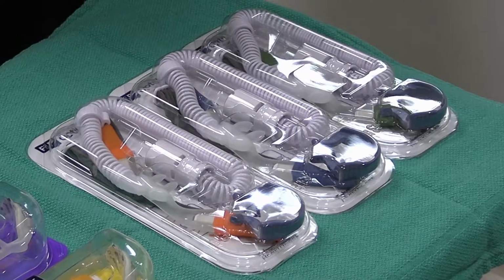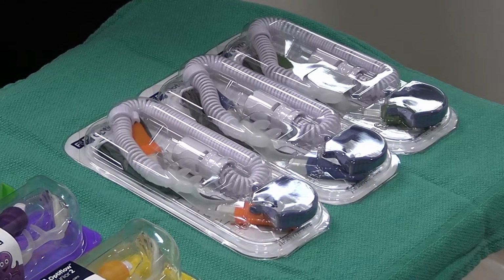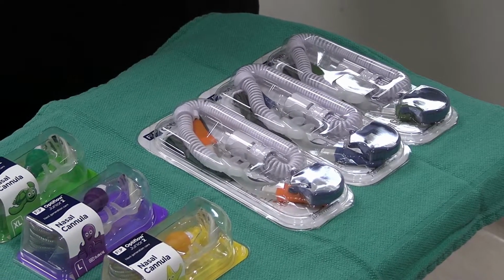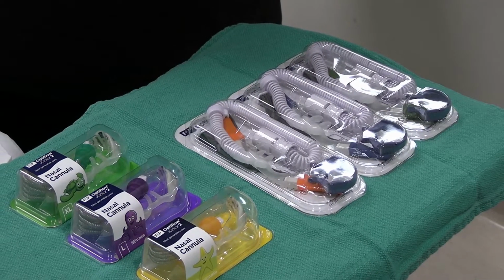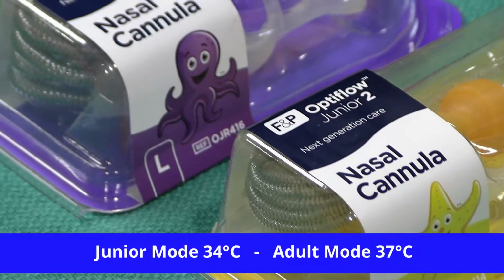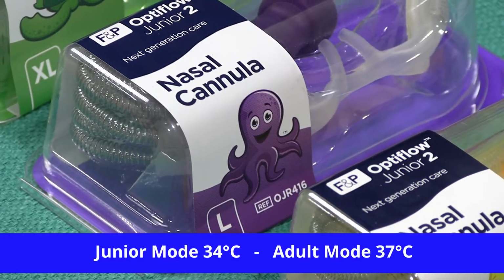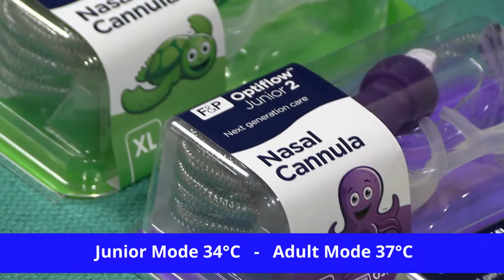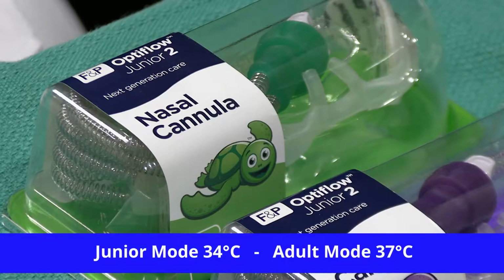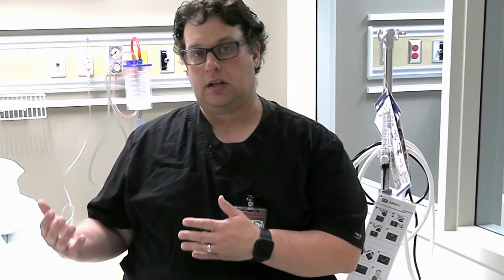Now with the AIRVO, we have the ability to deliver high flow oxygen therapy to newborn babies all the way up to adults. And we have different consumables based off of the size of the patient that you are applying the therapy to. But with the pediatric population, the AIRVO device has a mode called junior mode. And that's where it is able to deliver oxygen therapy at a heated level of 34 degrees Celsius. In the adult mode, it actually goes as high as 37 degrees Celsius. So with the pediatric mode as a safety, they have a little less temperature, but you're able to moisten and condition the gas for it to be more comfortable for your patient.